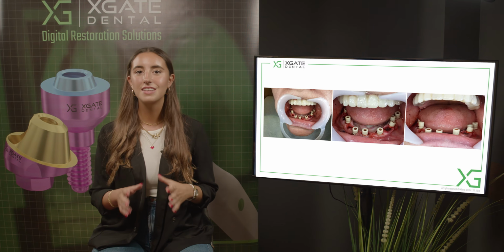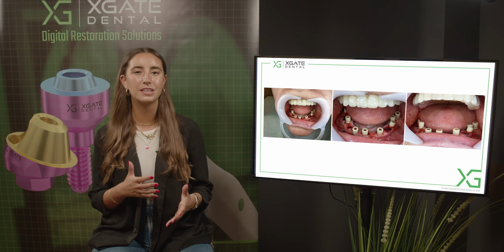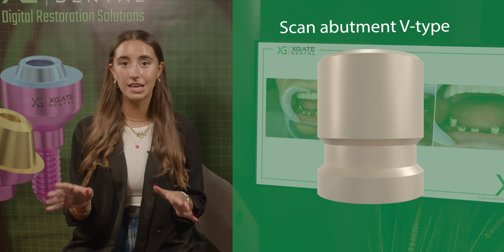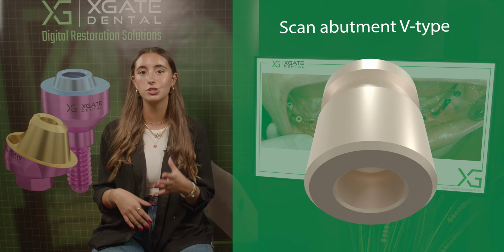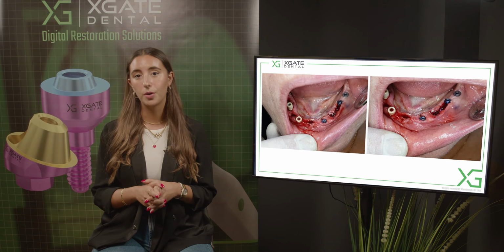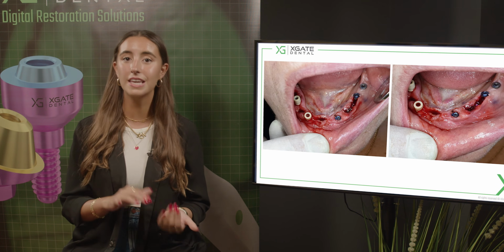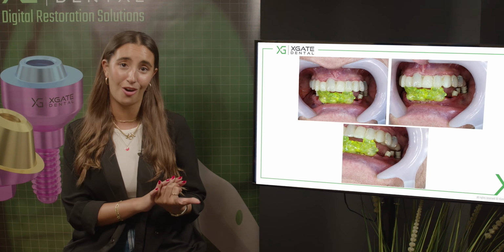You can also see the sockets of the extracted teeth. You can see the scan abutments and you can see a little bit of blood in the scan abutments. We took an impression from all of the scan abutments, and in the second stage, we want to construct some material to have relations for the lower bridge, for the lower part of the bridge. In this case, after we took impressions only from the scan abutments, we will take impressions from the scan abutments with some material on them.